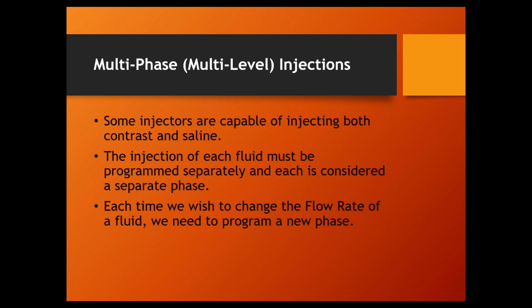So I actually have 2 syringes. And you'll notice on my display here, for people who can see it, I have the blue and the green. There are my syringes right here. It tells me on the display how much fluid is in each syringe. The green one is my contrast syringe. The blue one is my saline syringe.